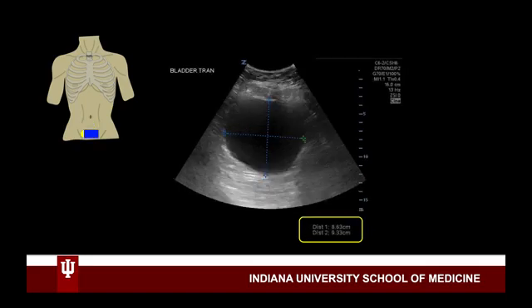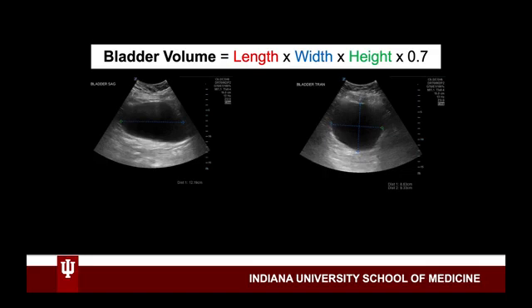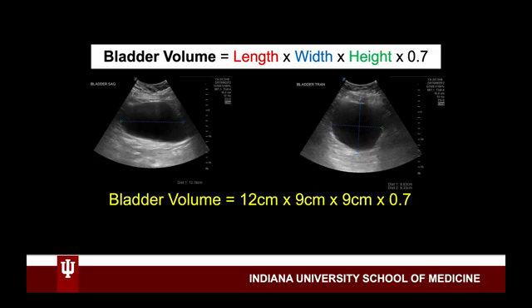Now we are going to obtain our height and width measurements by rotating the probe so that the marker dot is pointed towards the patient's right. We are now in the transverse orientation. Freeze the image when the bladder is the largest, then measure the height and width. Round these measurements to the nearest centimeter. For this patient, the height is 8.63 centimeters, so we round it to 9 centimeters, and the width is 9.33 centimeters, which we round to 9 centimeters. Bladder volume is 12 by 9 by 9 centimeters times the correction factor of 0.7, giving us 680 cc as our total bladder volume. Pretty easy, right?